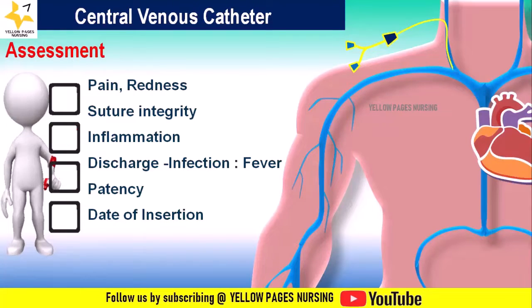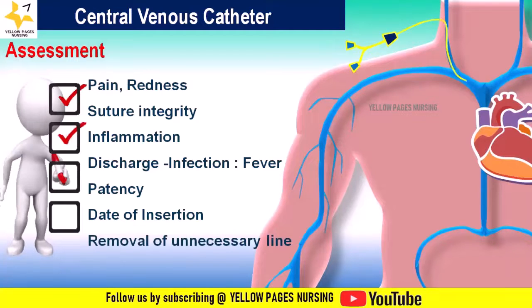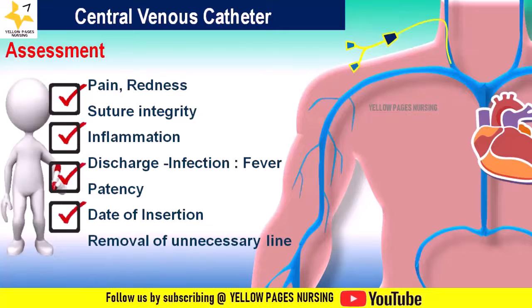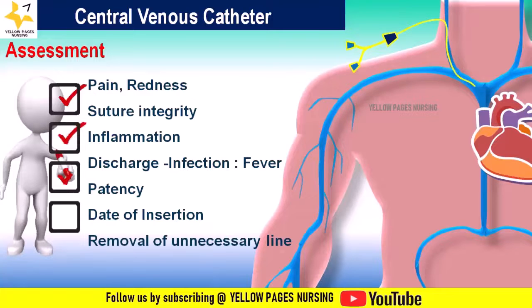Next is removal of unnecessary lines. Once the infusion gets over, remove the line immediately and don't keep the empty line for a period of time in order to prevent backflow.